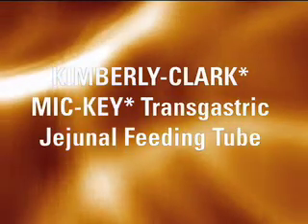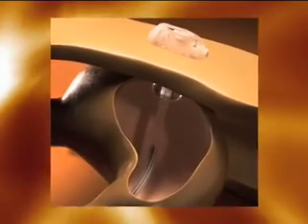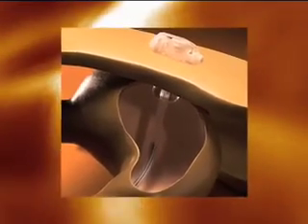The Kimberly-Clark Mickey Transgastric Jejunal Feeding Tube provides for simultaneous gastric decompression and drainage and delivery of enteral nutrition into the distal duodenum or proximal jejunum.